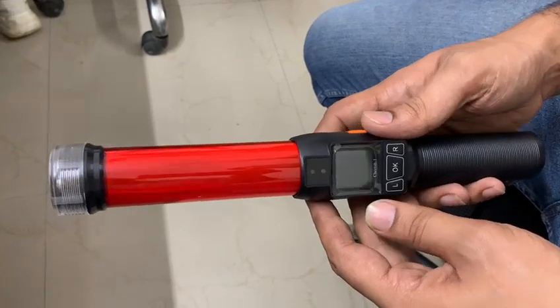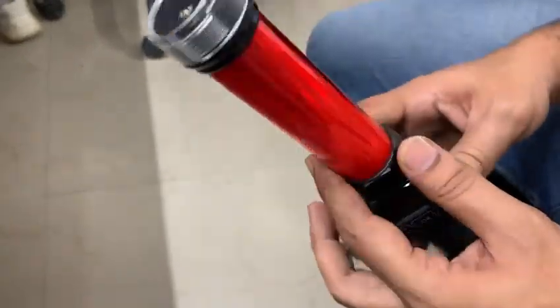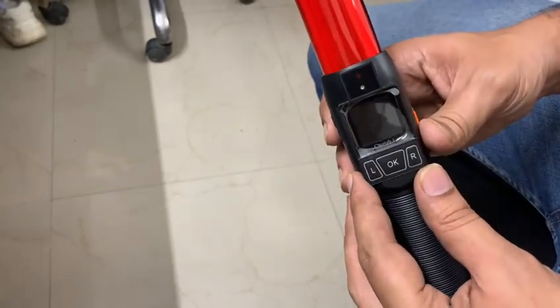This is a non-contact type alcohol tester. The model is Cheetah 1.